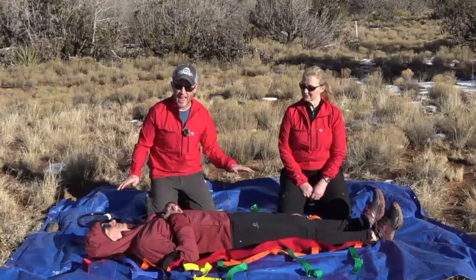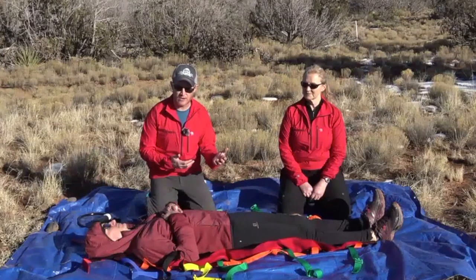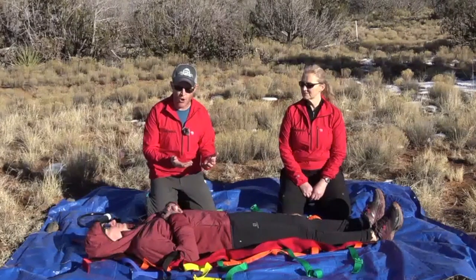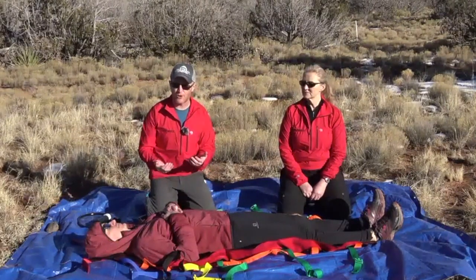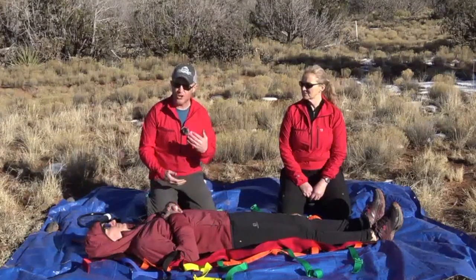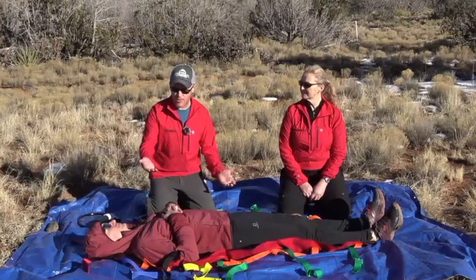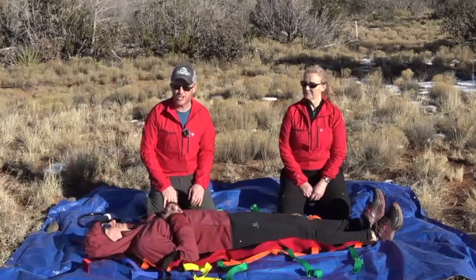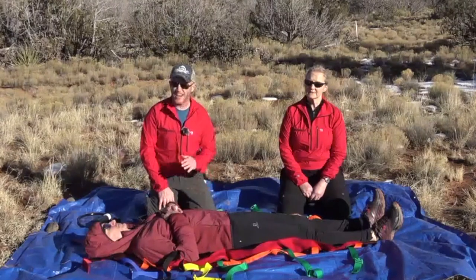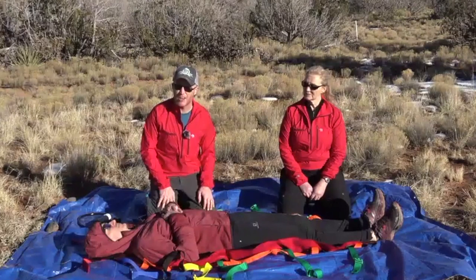You'll also notice that we're working on a tarp today. Some of that's a practical consideration because it's pretty muddy out where we're filming. But that's actually a very reasonable thing to do in an actual operational scenario, particularly if you're in a desert environment where there might be cactus or sharp rocks that could potentially damage your equipment. Also, you want to try to keep your equipment clean. If you're going to be packaging your patient into a litter, then this tarp could form the basis of weather protection or your hypothermia wrap.